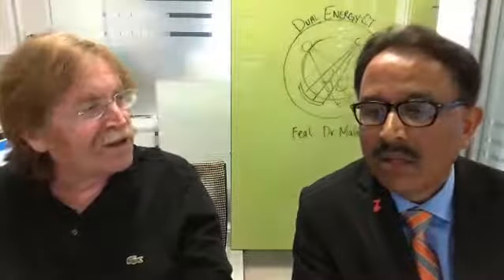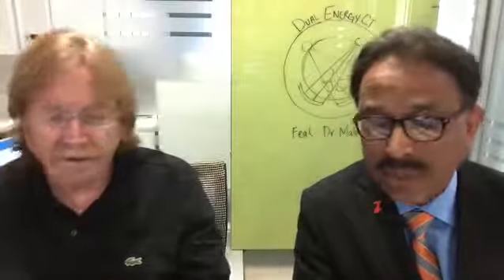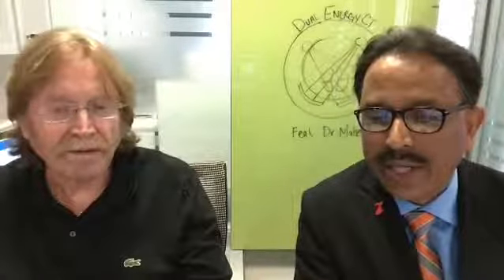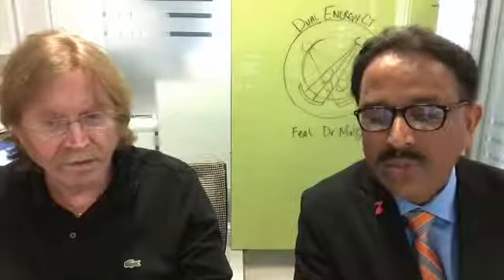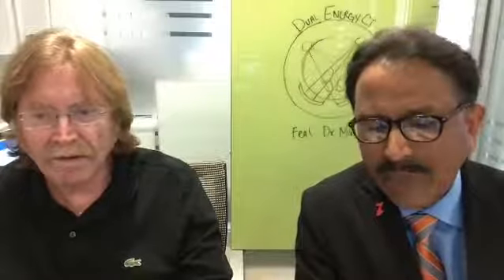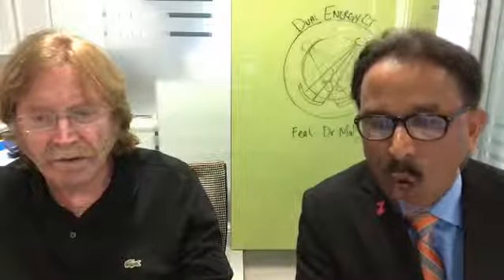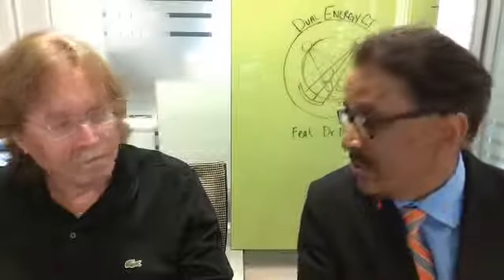You begin to start thinking, oh my God, I'm doing all these things, perhaps the dose is going up. That's a very good question, because that's one thing we also started to worry about with dual energy: are we doing dual time, double dose? I'll tell you why. Each manufacturer has been very careful to get the dose from the dual energy protocol almost the same as a single energy protocol. They knew if you come up with a higher dose, nobody will use this application.